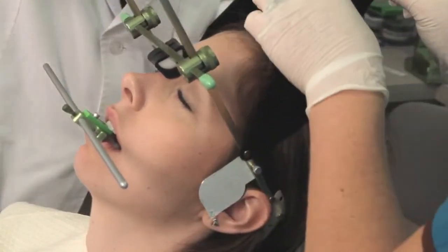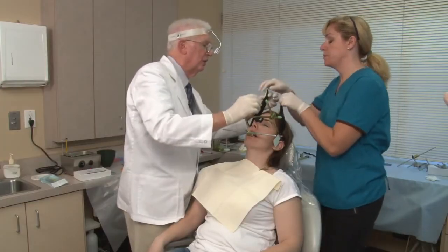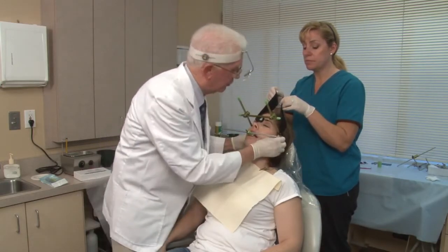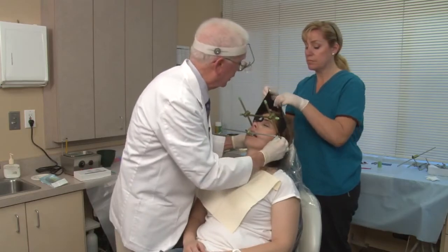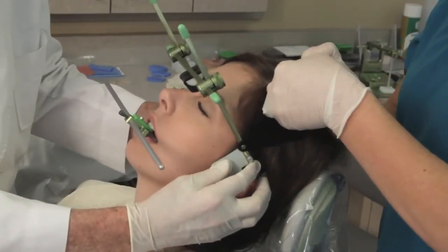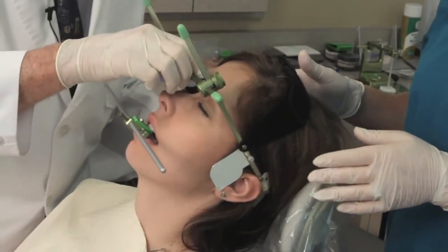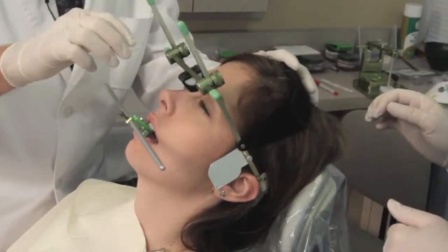Okay, now let me lift it off. You take both of them, and I'll lift it off the ears. When I get it off the ears, okay, now hook them together. Okay. Are you okay, Allie? Yeah.